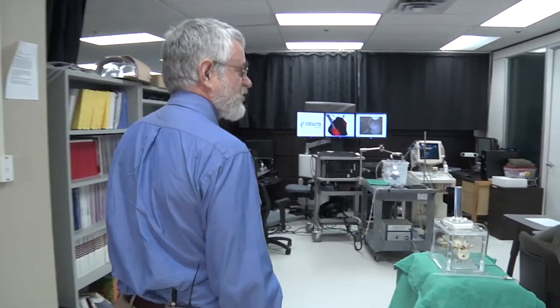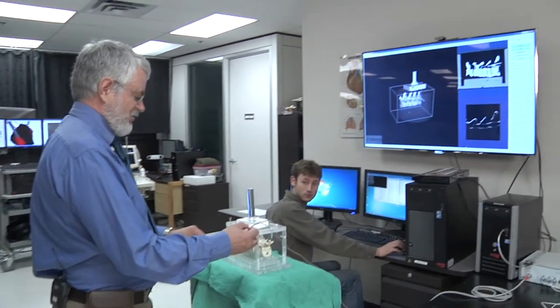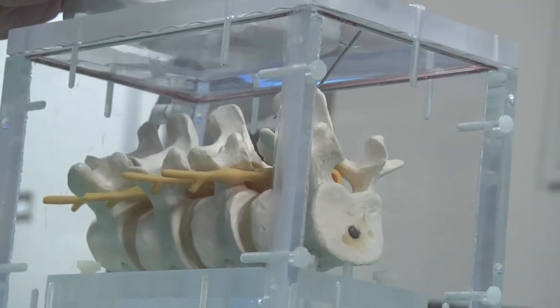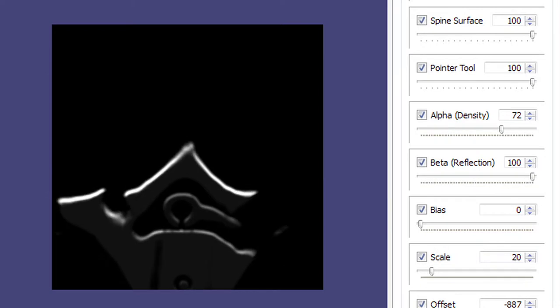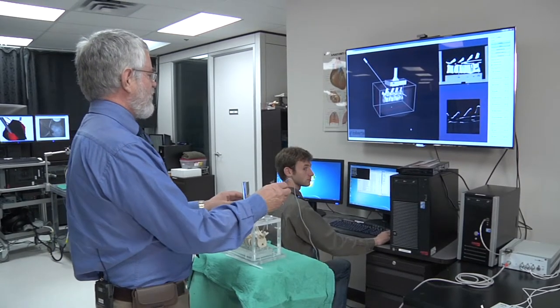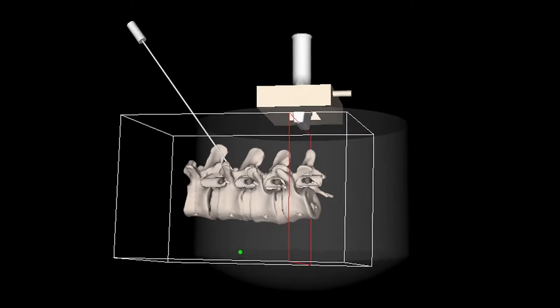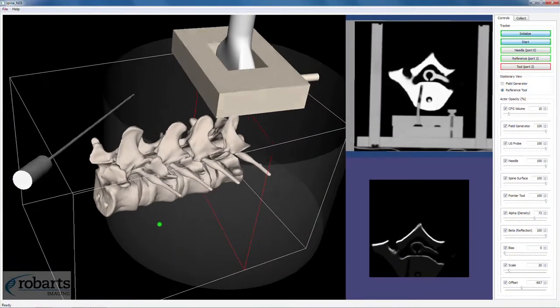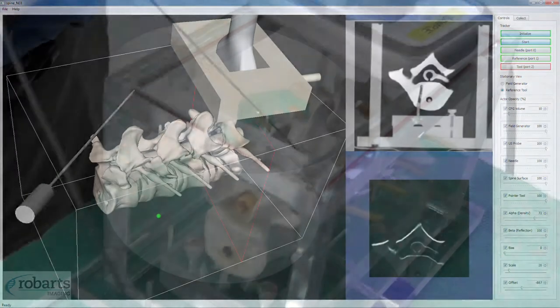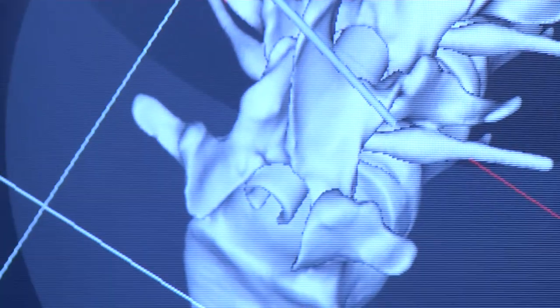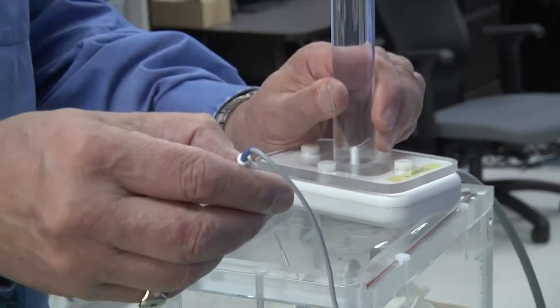The first one relates to the ability for an anaesthetist to place an anaesthetic agent accurately within parts of the spinal column. Typically he might just use ultrasound, and in the bottom right hand panel you can see what a typical ultrasound image looks like, but that doesn't help him get the needle to the right place. Using ultrasound allows us to register a pre-operative CT scan of the patient's spine to the patient, and when we do that we can get a virtual representation of the needle in the three-dimensional image of the spinal column. If Jay can just rotate the image a little bit, we can see how the anaesthetist can accurately target the place in the spinal column in which to place the anaesthetic.